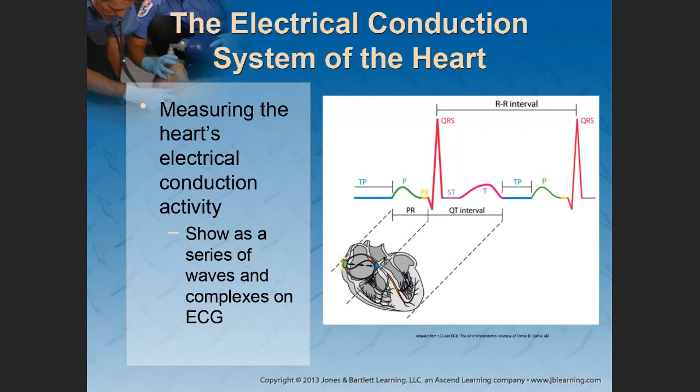Let me use my pencil. The ST segment should not look like this. So it shouldn't be down here. That would be a depressed ST segment, and it should not be up here. It should not be elevated, and it should not be depressed.